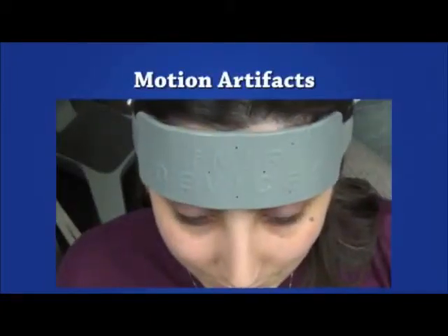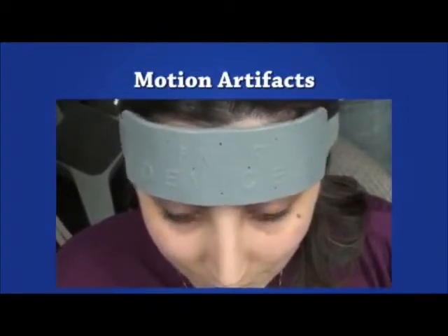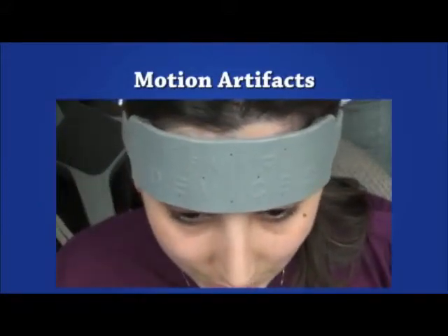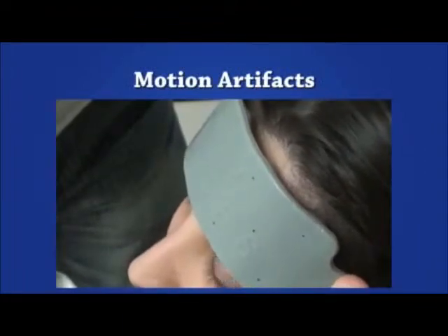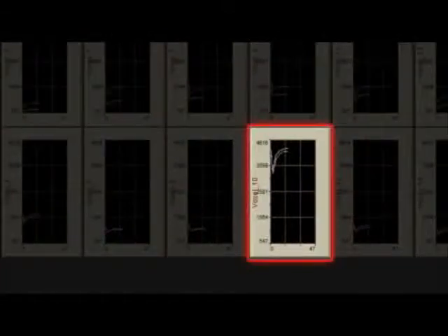To eliminate these physiological artifacts, finite impulse response and linear phase low-pass filters are used. Signals might also be corrupted by motion artifacts. When the FNIR sensor, light sources, and/or detectors slide from their original attached location or lose contact with the skin due to head motion, unexpected sudden bursts or spikes can happen in the FNIR measurements. Furthermore, if the light source loses coupling with the skin, the detector may record either very low values, since no light may pass towards it, or extreme high intensities and momentary saturation, due to the reflected light from the surface of the skin.